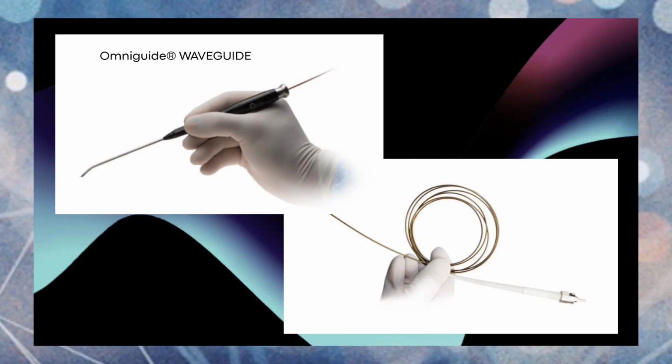So you have to regulate your selection of energy, and you have to vary it a little bit. You have to start with a slightly lower energy and work your way up till you get a good working energy, and realize that it's going to be affected by your positioning of the laser fiber and the angles. Not terribly, but it will a bit. The other side effect of that phenomenon is that these fibers burn up. They actually heat up enough to stop working.